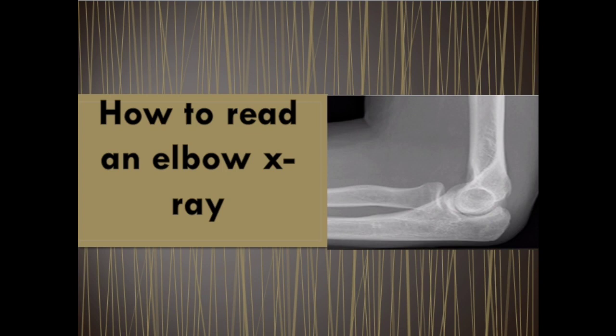As-salamu alaykum. Hello everybody. Today we'll talk about how to read an elbow x-ray. As you know, fracture lines can be difficult to visualize after acute elbow injury, particularly in children. We will discuss sequential steps that aid in the radiographic recognition of occult signs of injury.